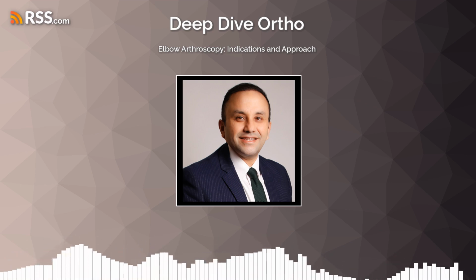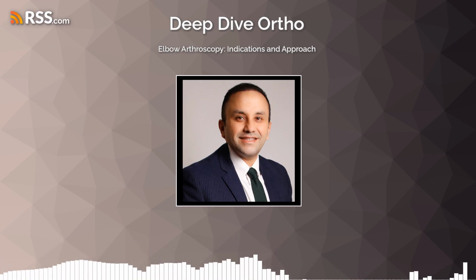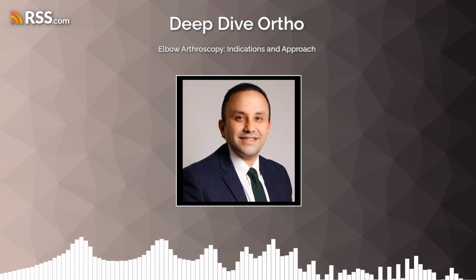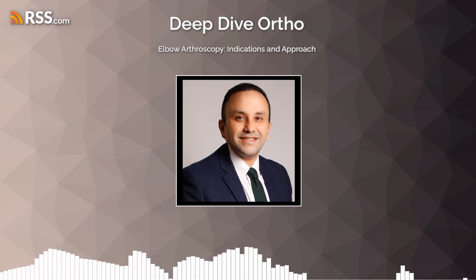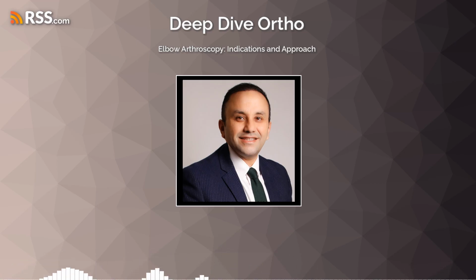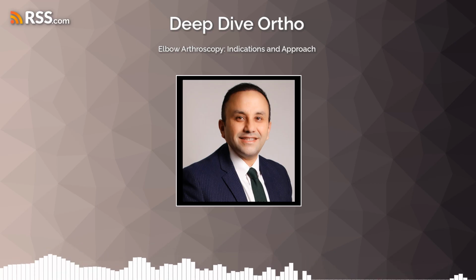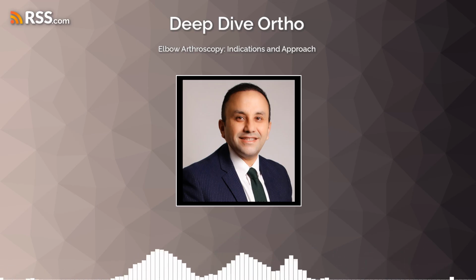Arthroscopy can also be used very effectively in conjunction with open surgery, particularly to avoid larger, more aggressive surgical approaches. However, certain conditions are generally excluded from arthroscopic procedures, such as muscle spasticity, cerebral paralysis, severe burns, previous surgeries that have led to significant anatomical alterations, extensive heterotopic ossifications, myositis ossificans, algodystrophy, articular instability, significant anatomic incongruence, and stiffness primarily due to active infection. A clear set of exclusions. And the surgery itself. How do you approach an arthroscopic release for stiffness?